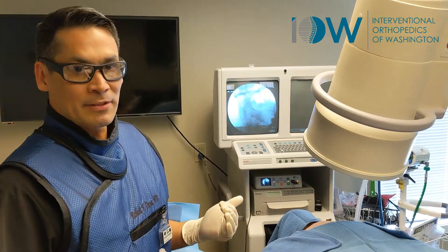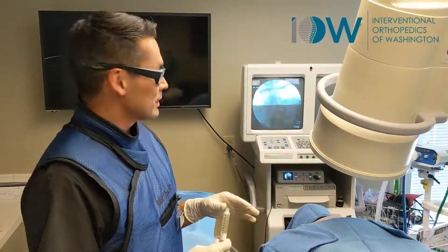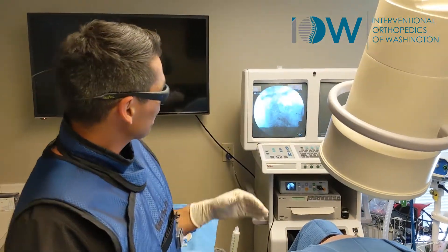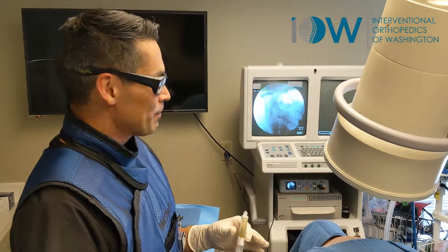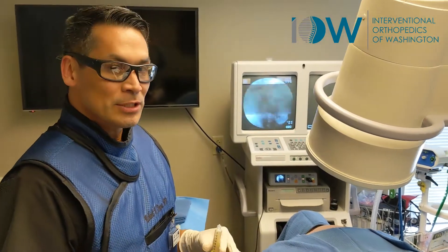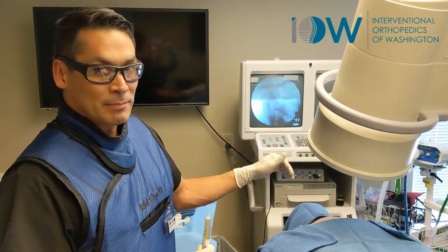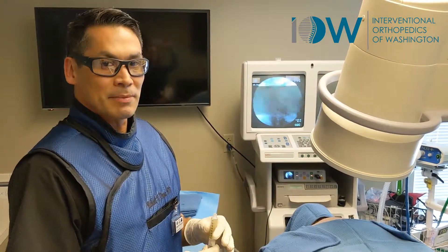If you're having radiating pain down to the arms, or any numbness or weakness, it should help that as well. You can see here, cervical spine — we're about to prepare this platelet injectate to go into the facet joints. And then we're going to use some dextrose prolotherapy all along the ligaments and spine to support the stability of that neck.